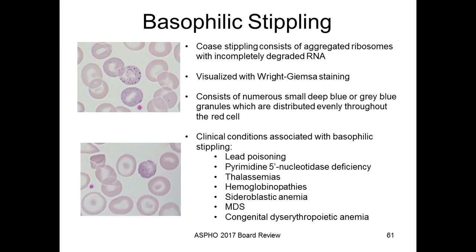And so the clinical conditions associated with basophilic stippling, well, classically, you'll see questions about lead poisoning, pyrimidine 5' nucleotidase deficiency, thalassemias, hemoglobinopathies, sideroblastic anemia, MDS, congenital dyserythropoietic anemia.